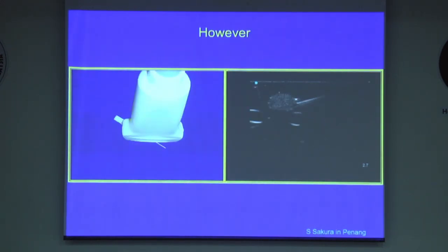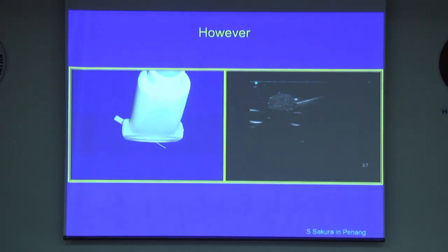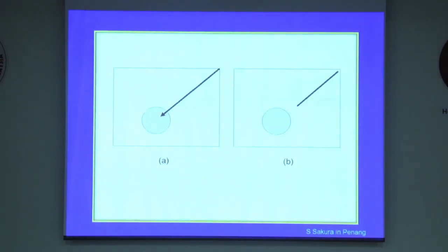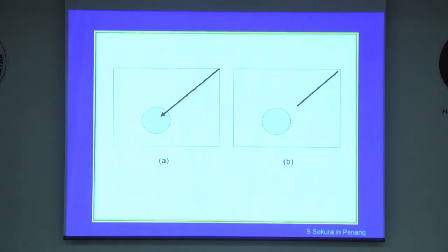However, because the ultrasound beam is very thin — probably one millimeter wide — a small deviation will cause part of the needle, and often the needle tip, to disappear from the image. So it is possible that when you see an image like this, the needle tip is already inside the nerve.